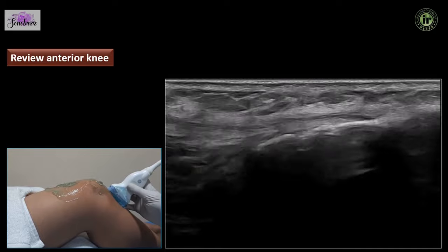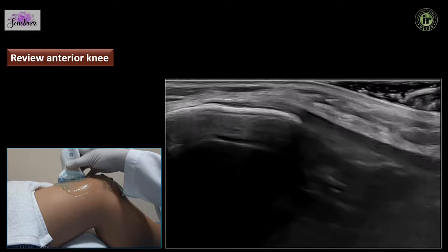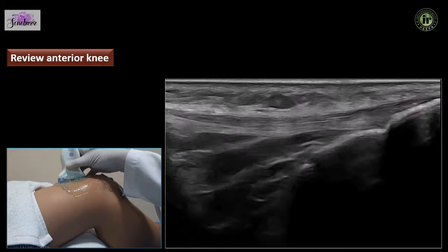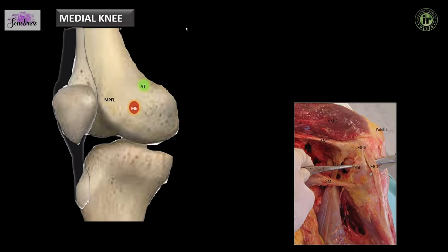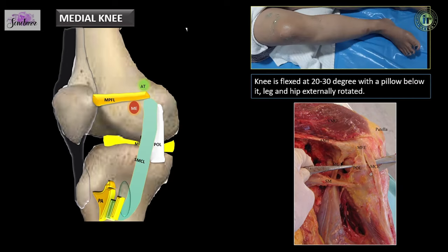Next we move into the medial compartment. On the medial aspect we are going to see the medial meniscus and medial joint line, the deep component of the medial collateral ligament which is fused posteriorly with the posterior oblique ligament and is overlaid by the superficial medial collateral ligament. We also have the MPFL, the pes anserinus tendons, and the pes anserinus bursa. The knee will be flexed at 20 to 30 degrees with the leg and hip externally rotated during examination.